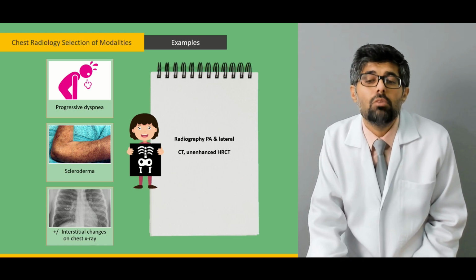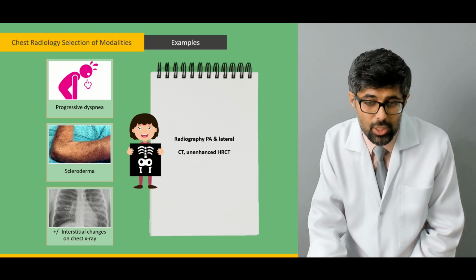And in this instance, we will go for the unenhanced HRCT.